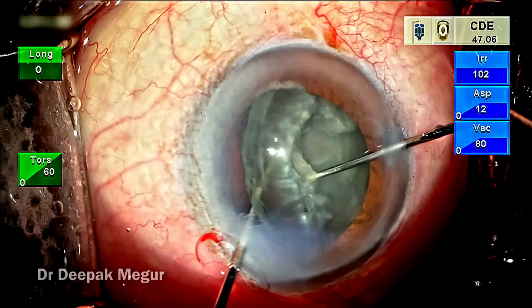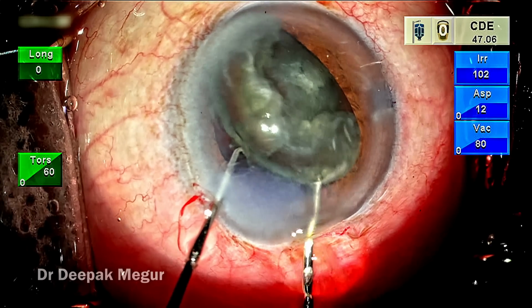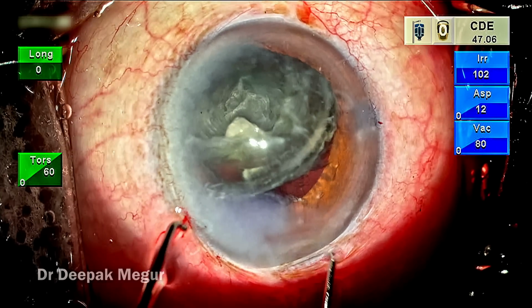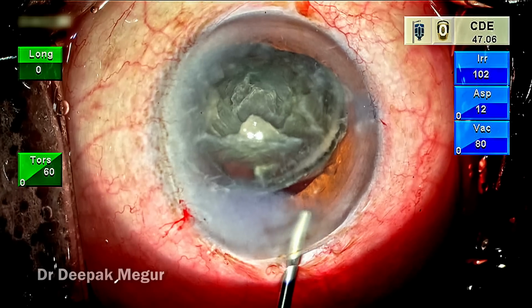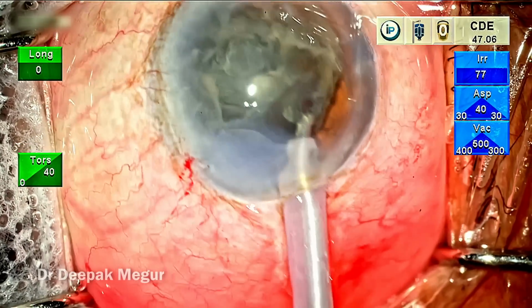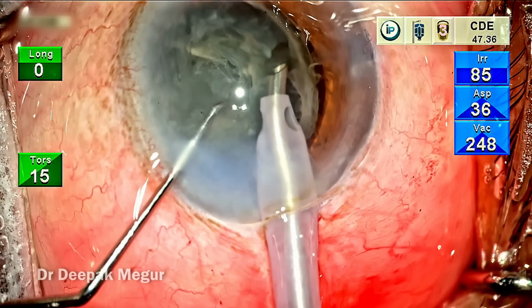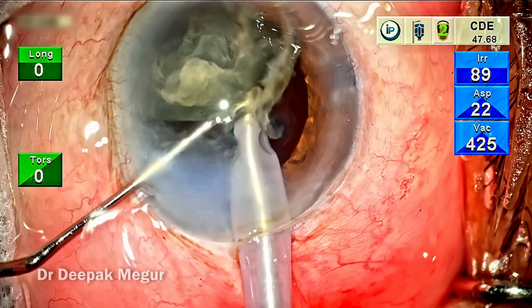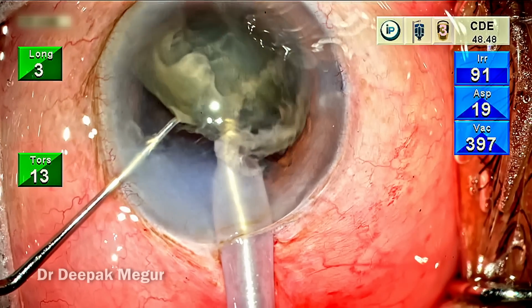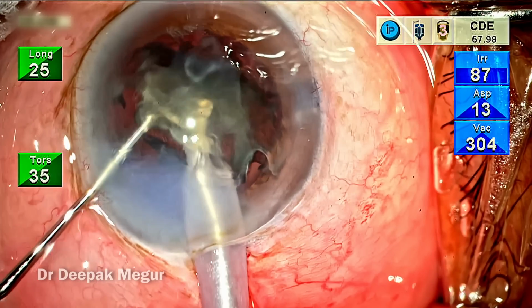So I put in a lot of dispersive OVD to protect the corneal endothelium, and 2 instruments are taken to maneuver the nucleus out into the antechamber. And because the nucleus is relatively softer, I go and emulsify it in the antechamber itself. And to prevent endothelial trauma, I'm just going to refill the chamber with OVD a couple of more times. So eventually the nucleus is taken care of.